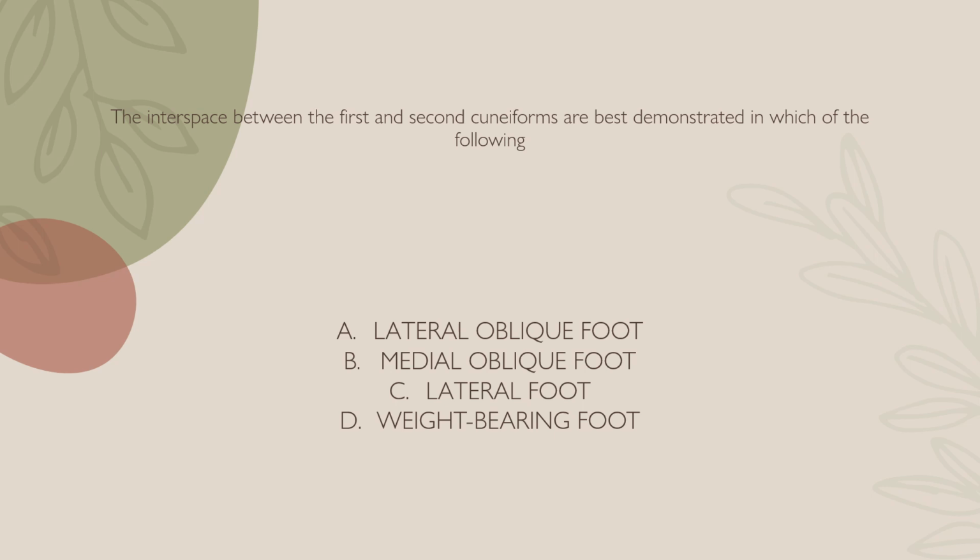The interspace between the first and second cuneiform is best demonstrated in which of the following? We have our lateral oblique foot, medial oblique foot, lateral foot, or our weight-bearing foot. And the answer is our lateral oblique foot.